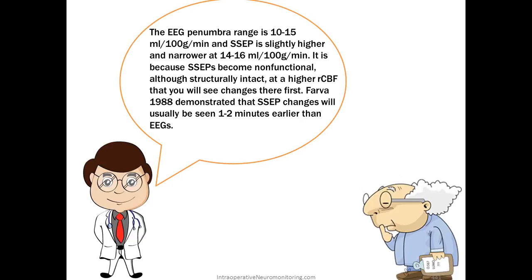But remember that it takes time to collect an SSEP, and if these changes are not slow hemodynamic changes but are a more rapidly changing effect, like an emboli or something, chances are you'll pick it up on EEG, because that is a continuous recording versus an evoked response.